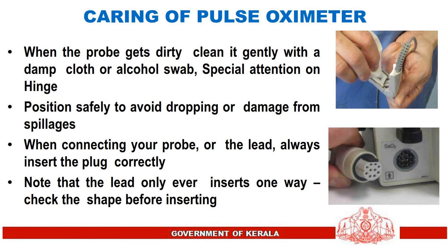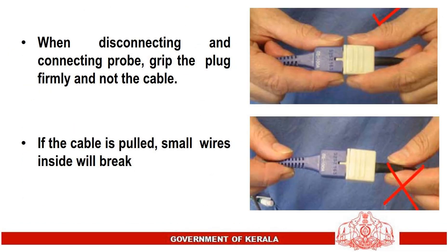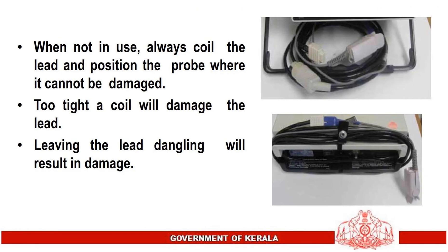Care of the pulse oximeter: when the probe gets dirty, clean it gently with a damp cloth or alcohol swab, with special attention to the hinge position. Store safely to avoid dropping or damage from spillages. When connecting the probe or lead, always insert the plug correctly — the lead only inserts one way; check the shape before inserting. When disconnecting and connecting the probe, grip the plug firmly and not the cable, as pulling the cable will break the small wires inside. When not in use, always coil the lead and position the probe where it cannot be damaged. Too tight a coil will damage the lead; leaving the lead dangling will also result in damage.